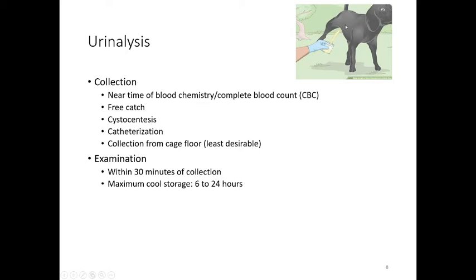When we do a free catch, we have to assume that there's going to be some bacteria, maybe some other things in the urine. So it's an easy way to get urine, to get a basic idea of what's going on with it, but it can be contaminated, so we have to be careful about that.